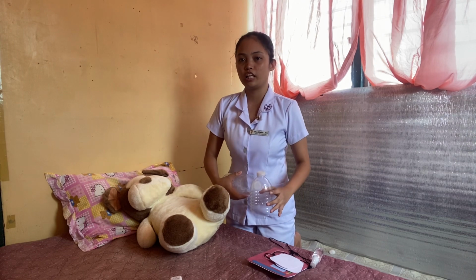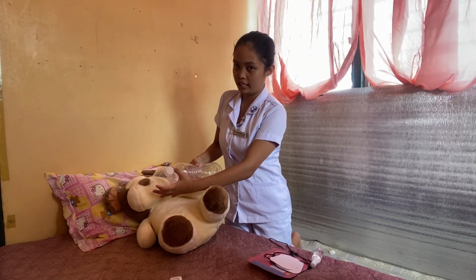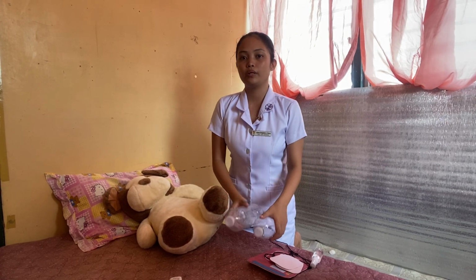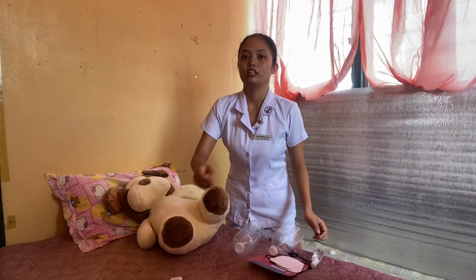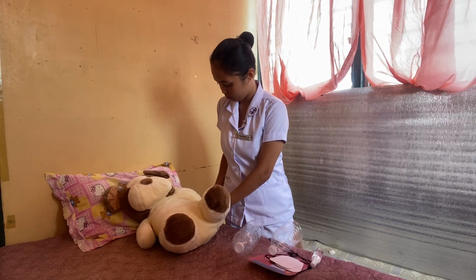To provide the proper ventilation, what we are going to do is breathe at 1 to 3 seconds, 40 to 60 breaths per minute. 1, 2, 3, 1, 2, 3. After doing that, someone will be attaching a heart monitor and pulse oximeter to the baby to determine the baby's heart rhythm and measure the hemoglobin oxygen saturation. This will help us to monitor the effectiveness of the CPR.